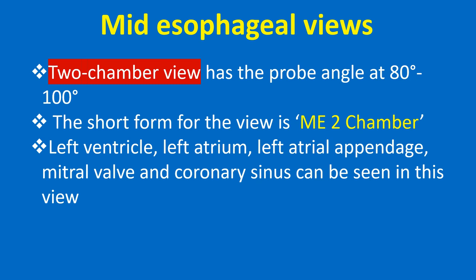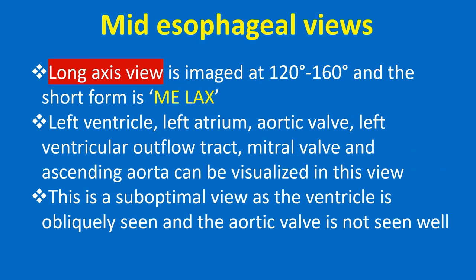The two chamber view has the probe angle at 80-100 degrees, known in short as ME two chamber. The left ventricle, left atrium, left atrial appendage, mitral valve, and coronary sinus can be seen in this view. The long axis view is imaged at 120-160 degrees, known in short as ME LAX.